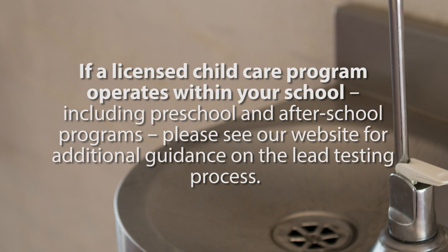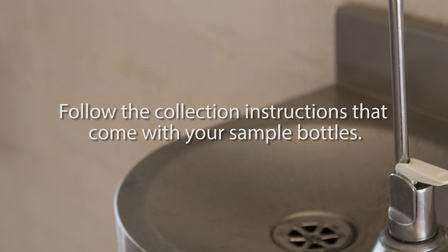For licensed child care programs operating in a school, including preschool and after school programs, please see our website for additional guidance on the lead testing process. Follow the collection instructions that come with your sample bottles.